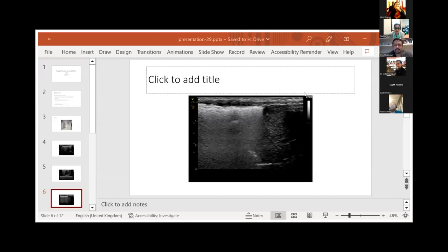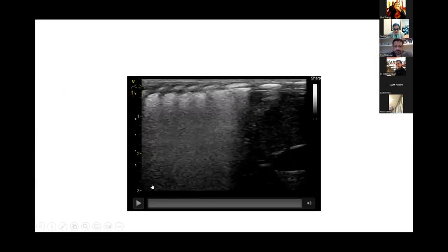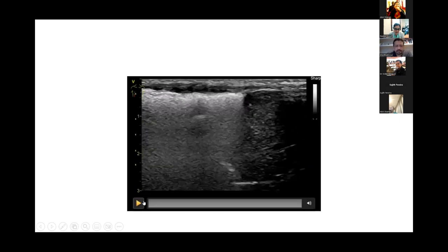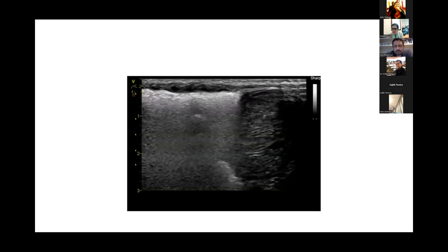So I think what Nadya is asking, Dr. Sharif, is that normally a consolidation that's visible in ultrasound should have some continuity with the pleural line. Yeah. So that's what she's trying to get to. That's exactly it. If you had a consolidation that you wanted to see and you wanted to switch the frequency to go deeper or have a better penetration, you would still always have some changes at the level of the pleural line. If you don't have any contact with the pleural line, even though it's a massive consolidation that goes all the way down, you will not be able to see it, right? Because it's surrounded by air.